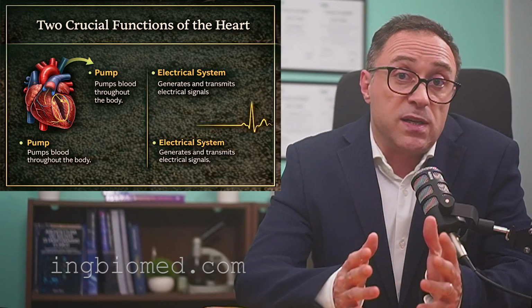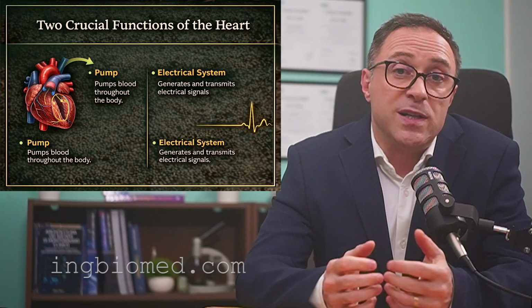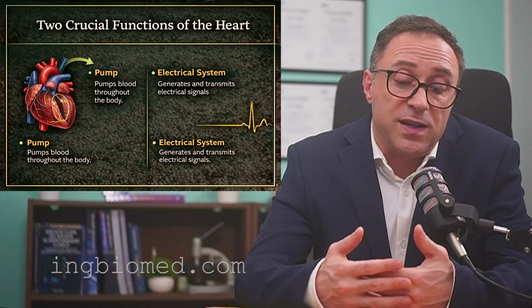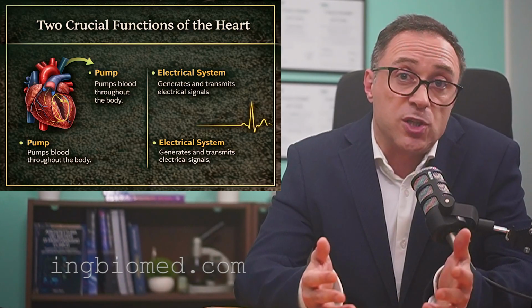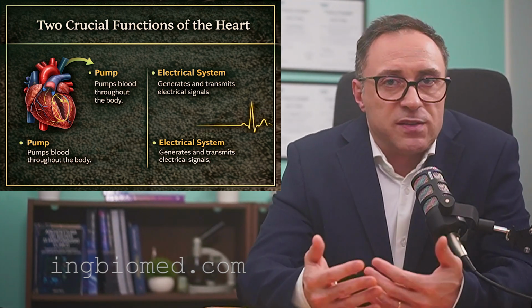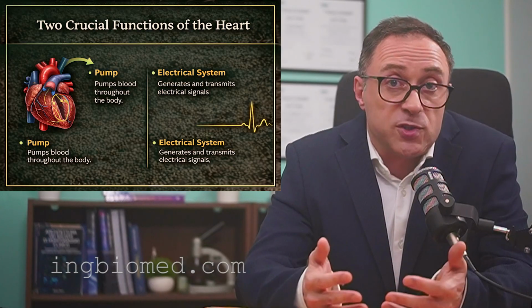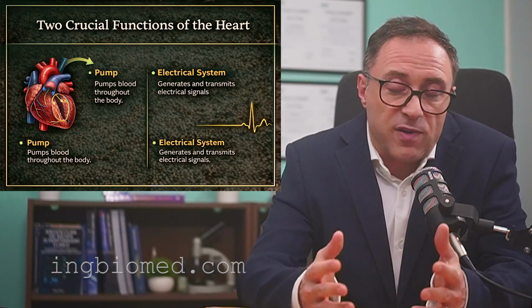During systole, the ventricle contracts and ejects blood, while during diastole, it fills. If we think in engineering terms, we are always looking at the relationship between pressure, volume, and time. If the electrical activation is not correct, the mechanical response will not be efficient. And this is exactly what we try to identify with imaging.